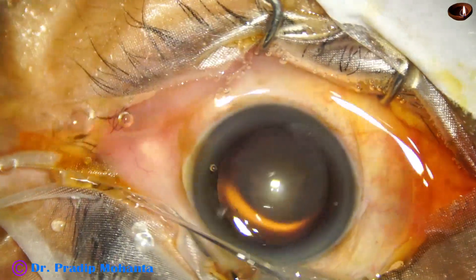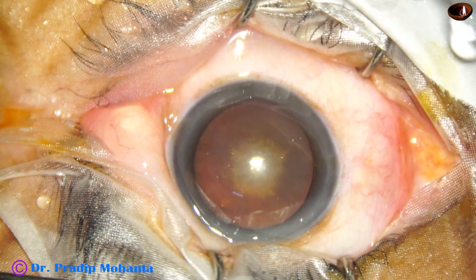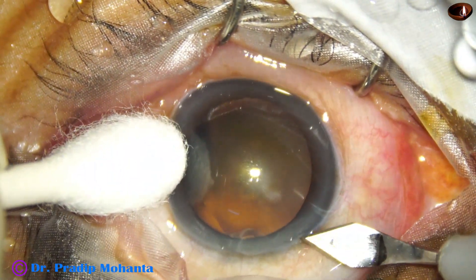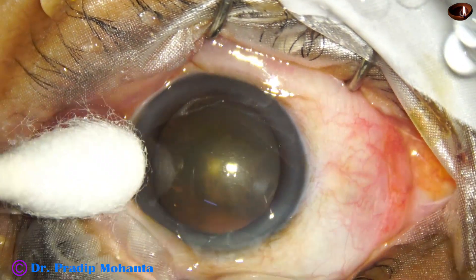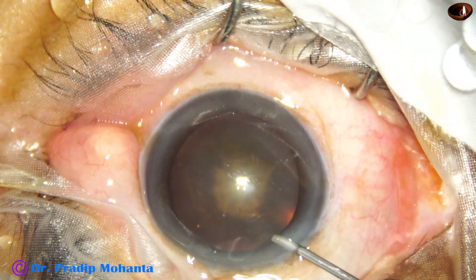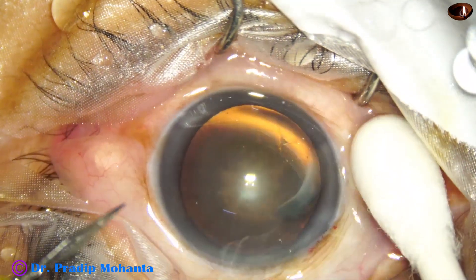In this video I am going to introduce a bit longer nucleus sustainer which is used in pre-chopping a nucleus. I have introduced a 1.7mm nucleus sustainer previously, and now for a deep chamber, this nucleus sustainer is more helpful. The tip length of the new nucleus sustainer, which is a bit longer than the previous one, is 1.9 millimeters.